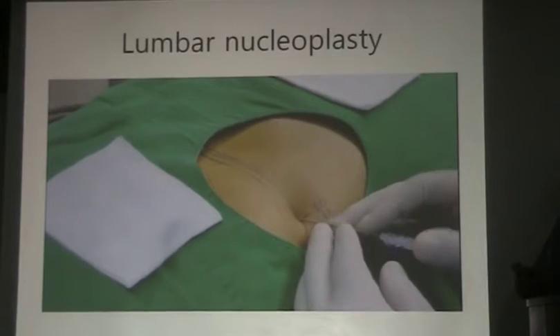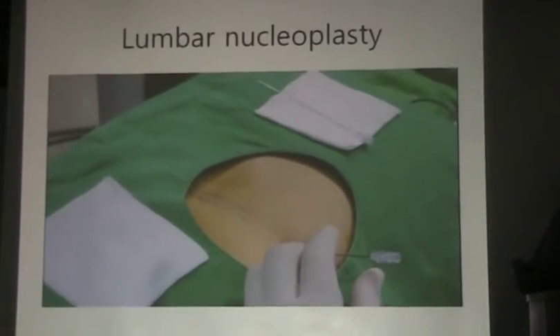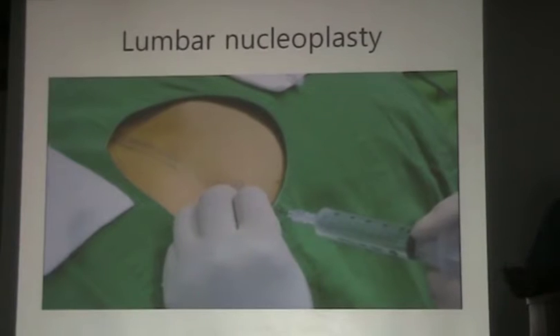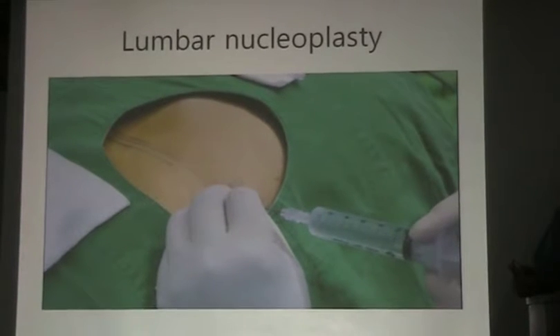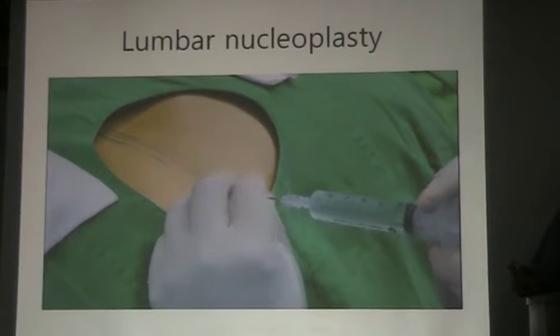Facet touch is very important, and facet block. You can do facet block also. And facet touch is very important to avoid nerve injury.